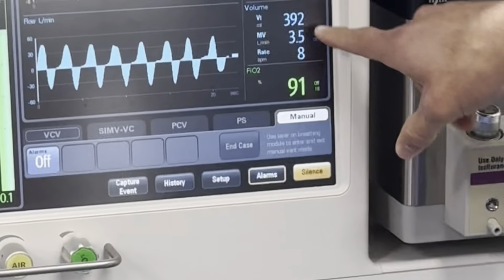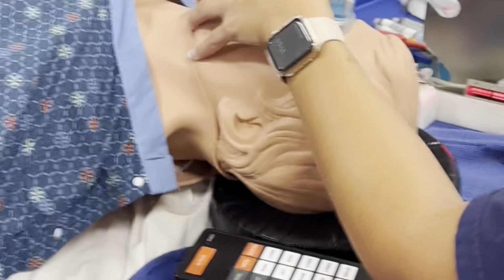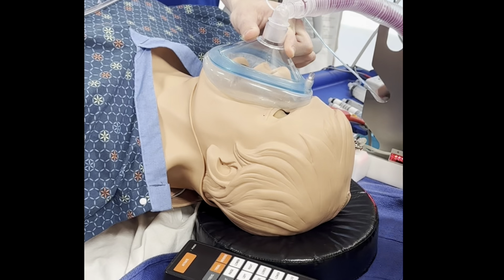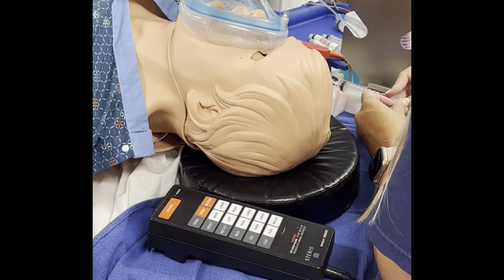What she means by tidal volume is the volume that she's now pushing into the patient, positive pressure ventilation. So now she has taken over the patient's breathing completely. If she doesn't squeeze that bag, the patient is not breathing. The patient is apneic. And then I'm gonna give the muscle relaxant to help the vocal cords open up so then you can stick the tube through the vocal cords into the trachea to help the patient breathe. Giving rocuronium, which is a muscle relaxant, to help open up the vocal cords.